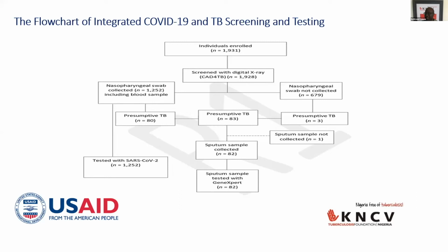1,931 clients registered. And looking at the SOPs, every registered client had to pass through the CAD4TB screening. Immediately after the CAD4, our cutoff in country was a score of 60. Everybody that passed through the CAD4 screening had the opportunity of passing through a tent where nasopharyngeal swabs were collected for COVID testing.